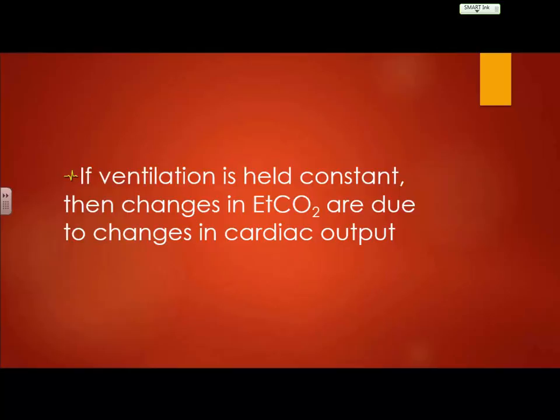What I just explained to you, summed up in one statement: if you are ventilating at a rate of 12, good tidal volume, good chest rise and fall, but then you notice that your CO2 levels are changing, based off of what has previously happened to the patient, why you're intubating the patient in the first place, that's probably going to be the underlying cause of your changes in CO2.